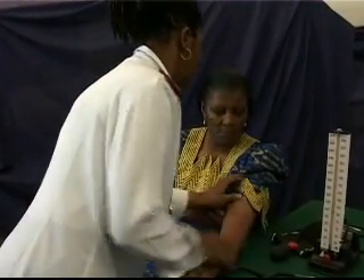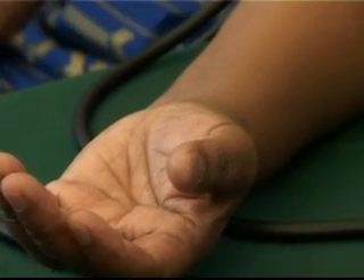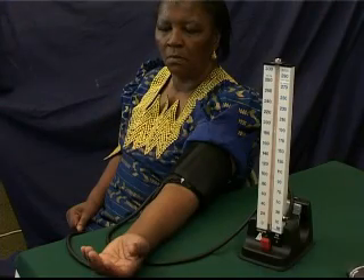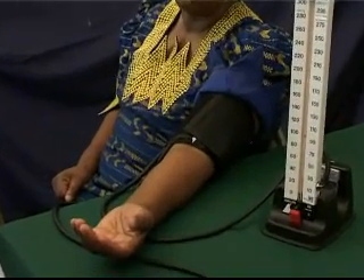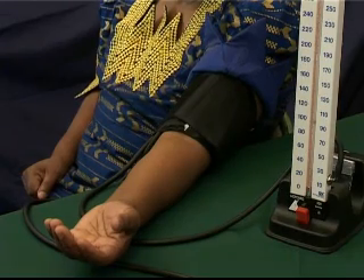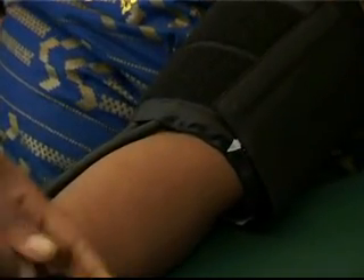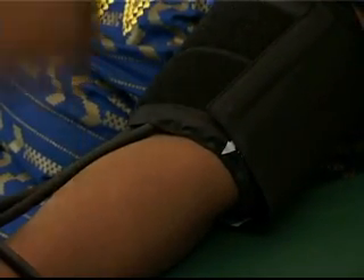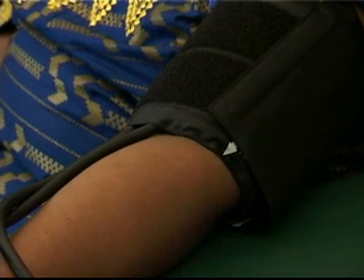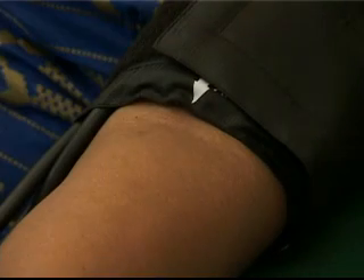The patient should be seated with preferably the left arm closest to the nurse. The arm should be relaxed and supported at heart level. The patient should be seated quietly and relaxed for approximately five minutes before the blood pressure reading takes place, and the patient and nurse should not talk during this procedure. The correct cuff size is then selected and secured firmly but not too tightly around the patient's upper arm, ensuring that the tubing is situated posteriorly so that the antecubital fossa is easily accessible for auscultation. The lower edge of the cuff should be 2 to 3 centimetres above the point of the brachial artery pulsation.